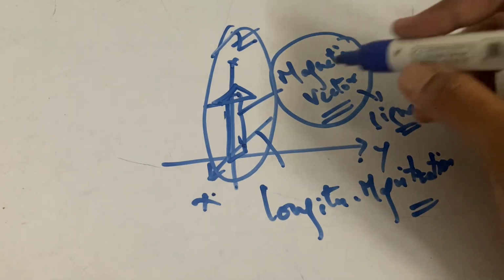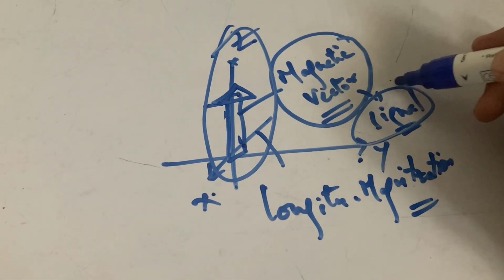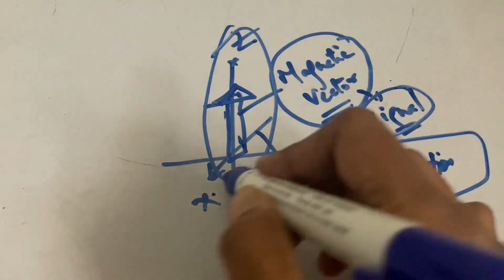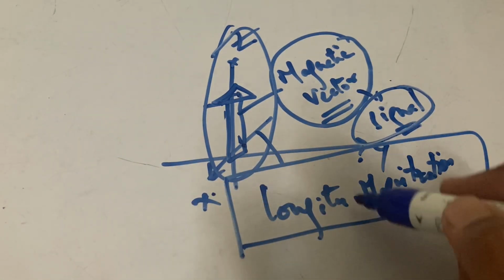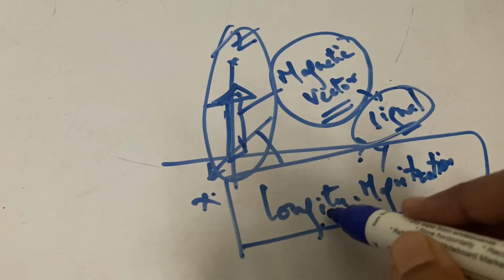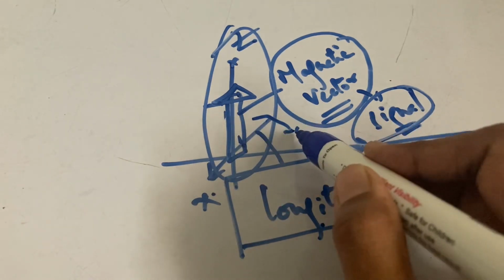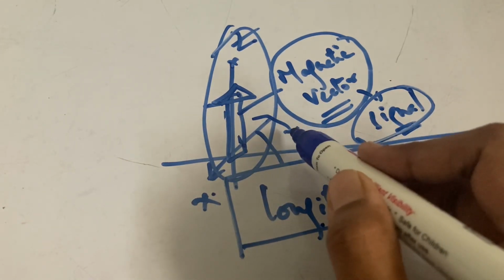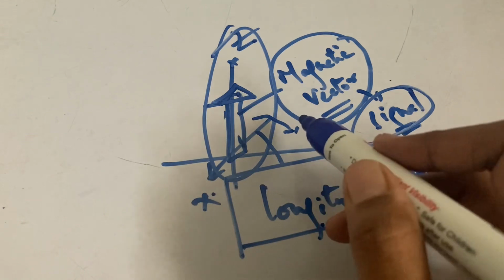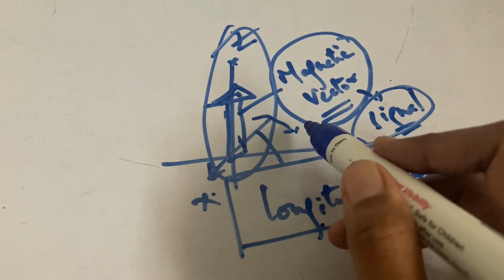As I told you, from this magnetic vector we get a signal. We have to measure this, but it cannot be measured because it is parallel to the external magnetic field. To measure this magnetization, it should turn to the transverse. So we need the magnetization which is not longitudinal but transverse to the external magnetic field. That's how we measure it.